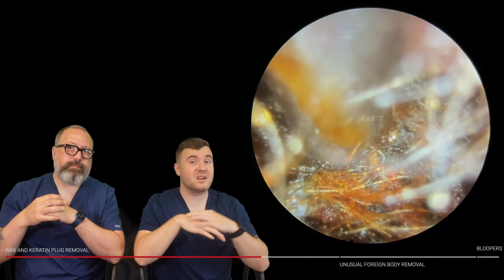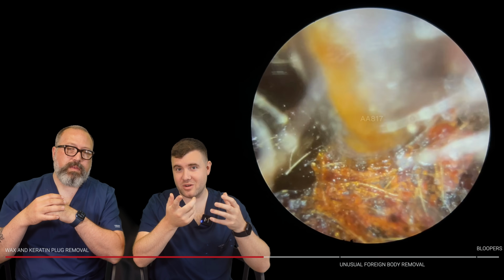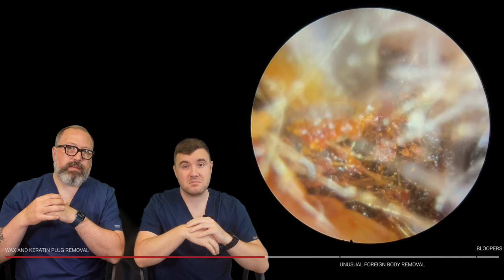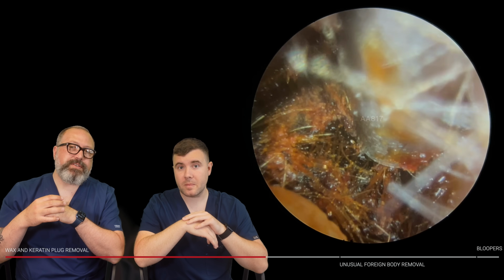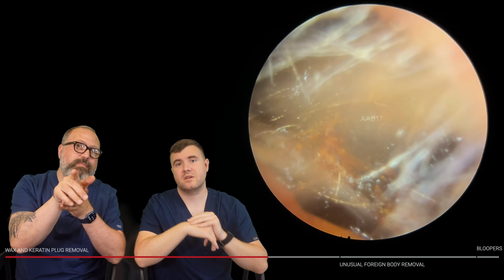Yeah, you can wiggle it as much as you want, and a lot of the time it just really won't go anywhere. So you're having to try and break little bits away like this just to try and create more space. Yeah. Now I can see there is a little gap. Oh, look at that for timing. Just that top left-hand corner on the other side.